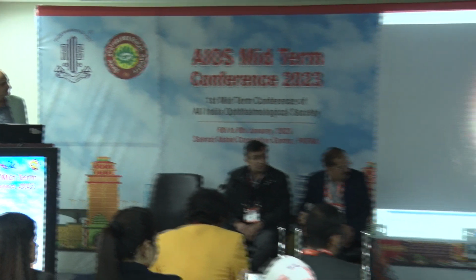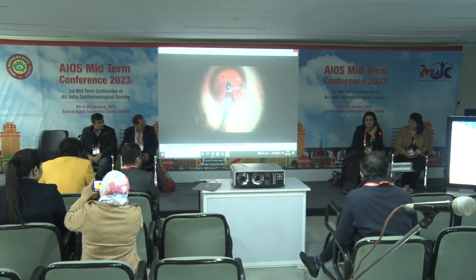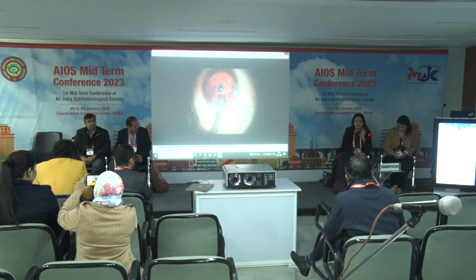Yeah, that is the best way of doing it. We all learn all these things after our rich experience and listening to such talks. I had done a phakic IOL, that is the antechamber IOL, and the patient developed postoperative glaucoma, had Urrets-Zavalia syndrome. But she was 6/6. The only problem she had was blur, in the sense that when she went out in sunlight, a lot of glare.